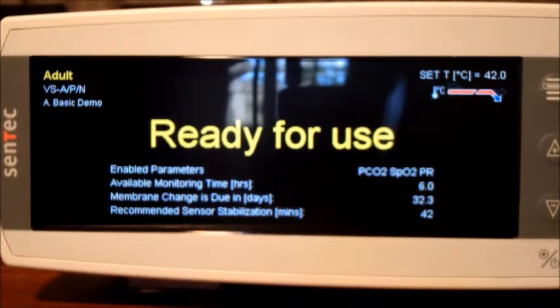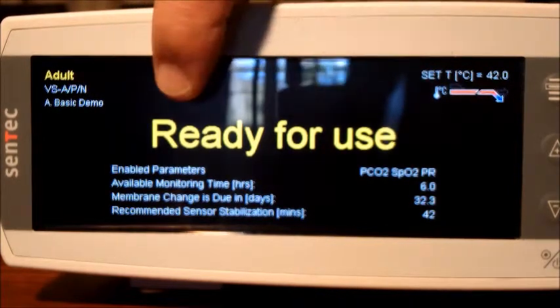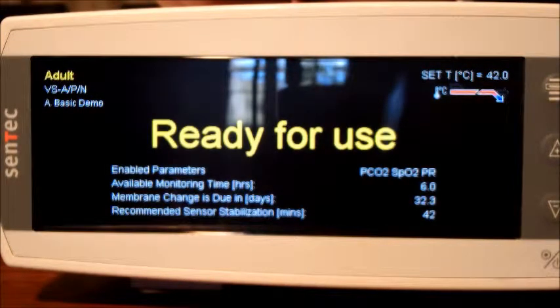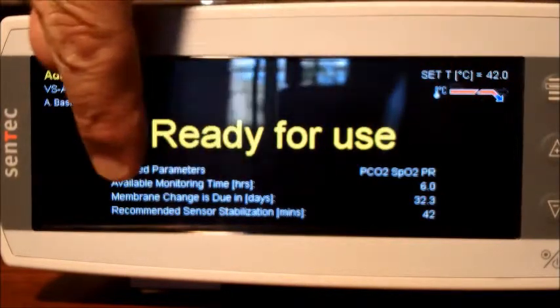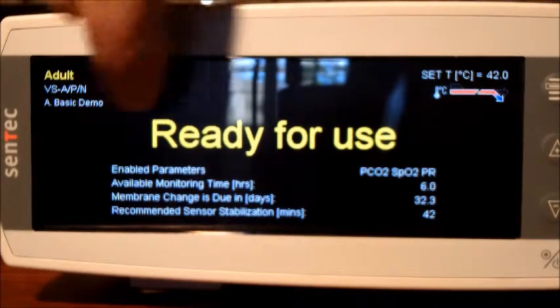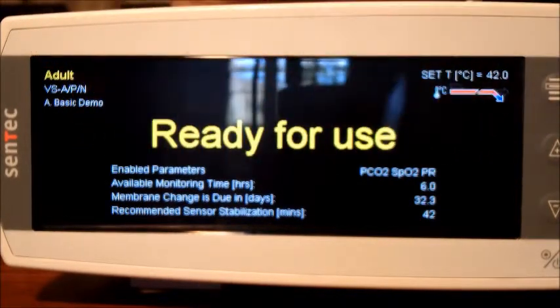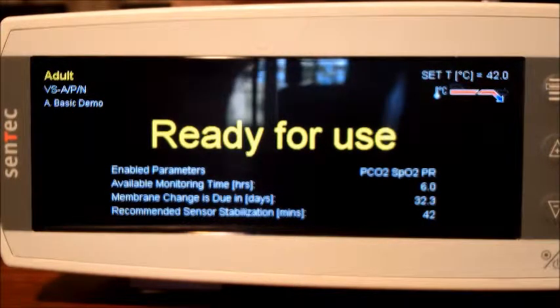Before we start we need to check the machine. It's just calibrated so it's ready for use. It has a valid membrane - membrane change due in 32.3 days, so that's fine. We have an available monitoring time of six hours, only six hours because it's just calibrated. If we leave it to stabilize it will go out to eight hours and then 12 hours, as long as the calibration interval and the site time allows it.